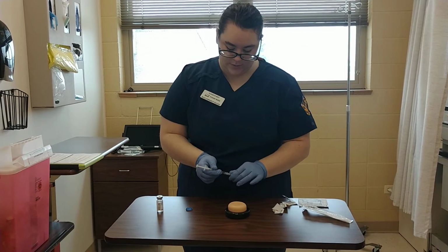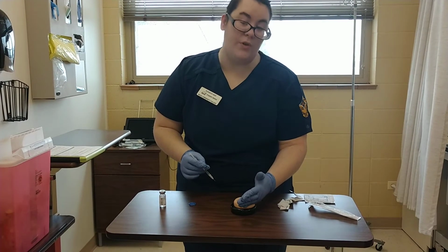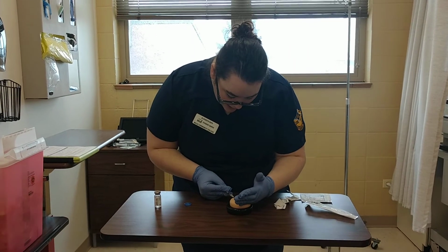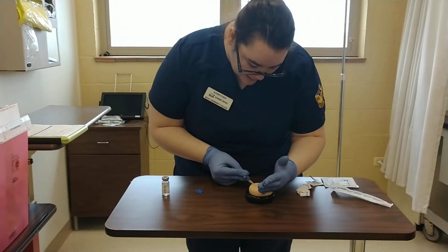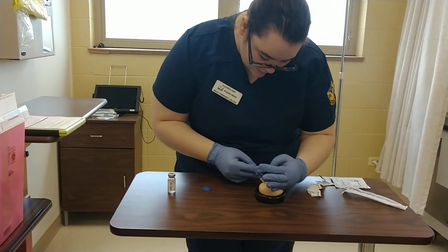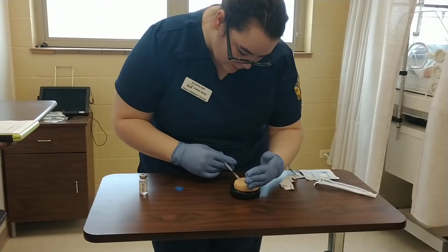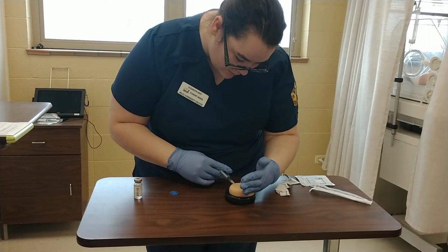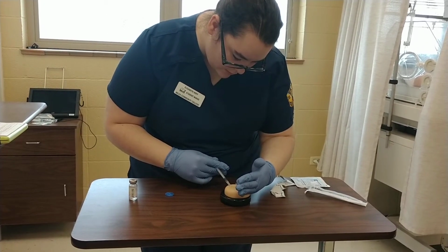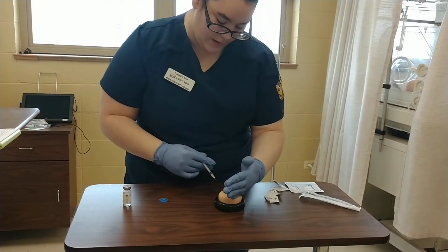I am going to hold the needle with my dominant hand, and with my non-dominant hand I'm going to pull the skin taut, and I'm going to enter the needle at a 5-degree angle into the skin, just past the bevel. Okay.